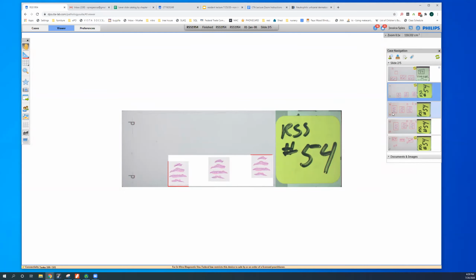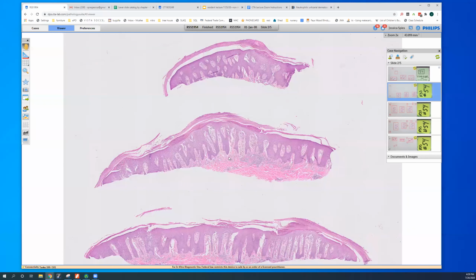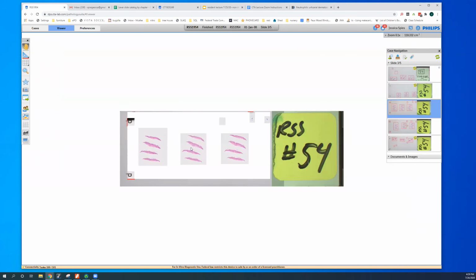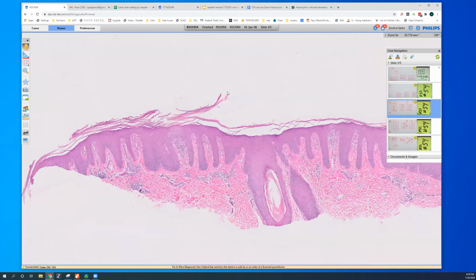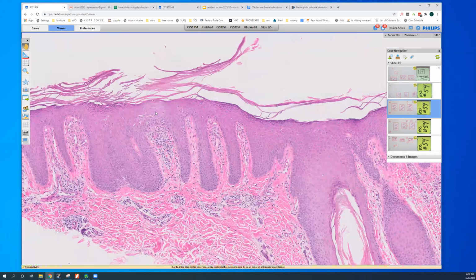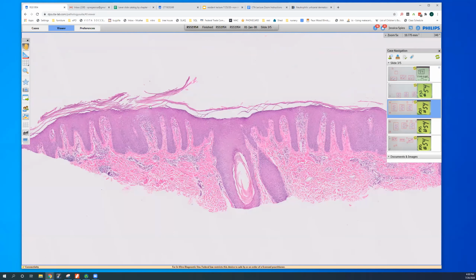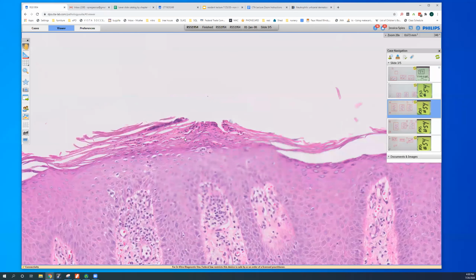And here's some other examples of psoriasis. This psoriasiform epidermal hyperplasia, you can draw a line here. The bottom of it's so regular. Even more. This one's maybe not as impressive, but see, it's got that stratum corneum lifting off the surface of the epidermis. And then it's got that diminution of the granular layer. Sometimes it's really hard to find the neutrophils. There may be one or two in here. Sometimes I have to do level sections to find them. Here we go. Here's a nice selection.